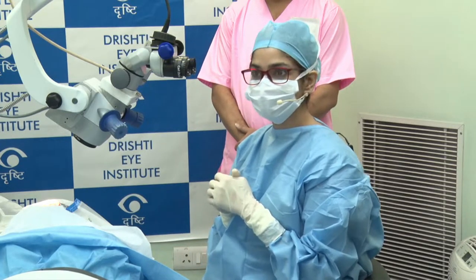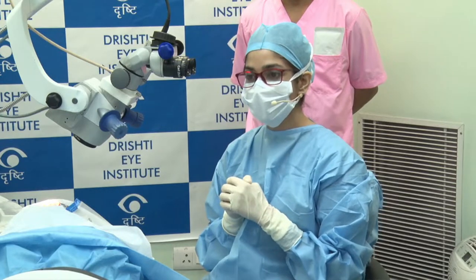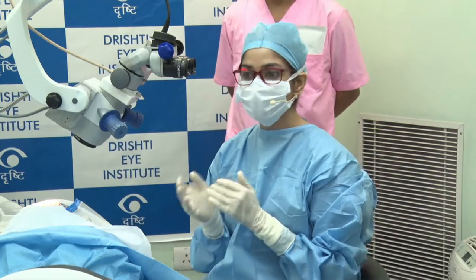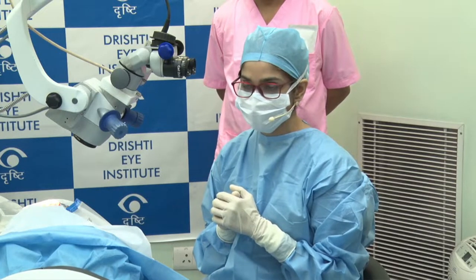Thank you. Would you like to combine it with cataract surgery? Yes, of course. If the patient does have visually significant cataract, it's usually done after the cataract surgery. And it probably takes 10 minutes more of your time and you're done in the same sitting.